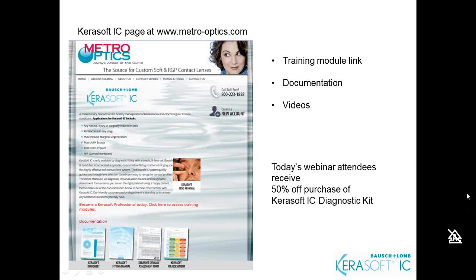Excellent. One of the questions is, it seems that the visual acuity results are opposite of what's expected with a soft lens. Is this specific to the KeraSoft IC lens? Actually, yes. Again, there is something very unique about the front surface optics. It's patented front surface optics with this design.